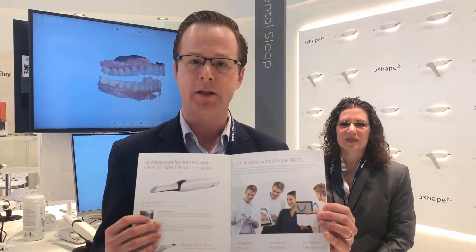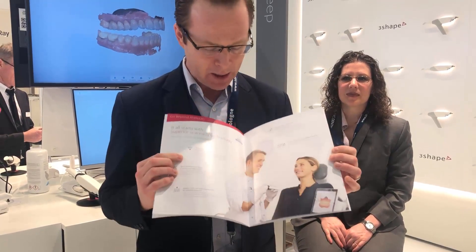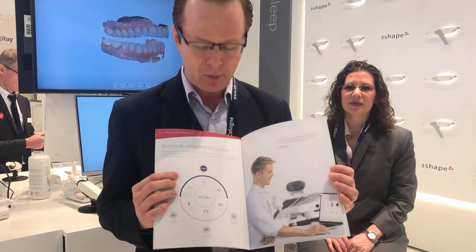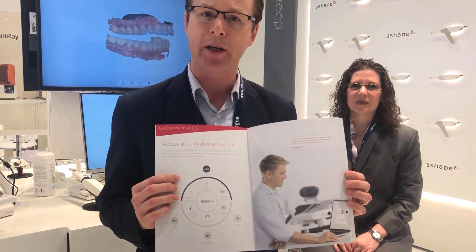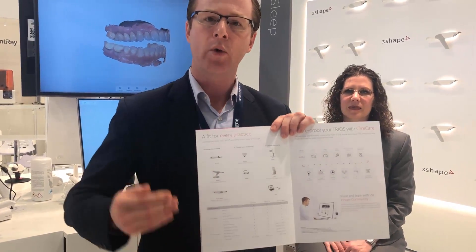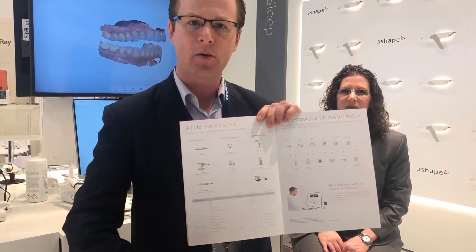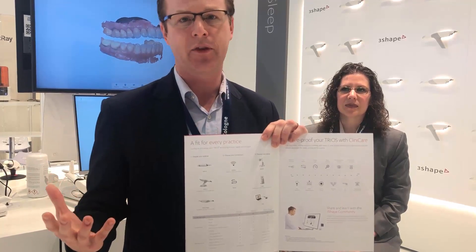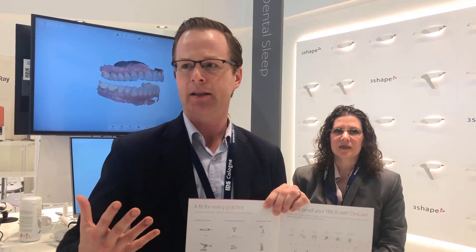You can see here they've developed an entire ecosystem of value-added services available with the Trios system. As I open this, they create integration and connection that brings the patient into the experience. You can see all the different features available with Trios Basic, Trios 3, and Trios 4. Since Trios 4 is the latest development from 3Shape, they're labeling it as their premium product — the ultimate scanner available in the market.